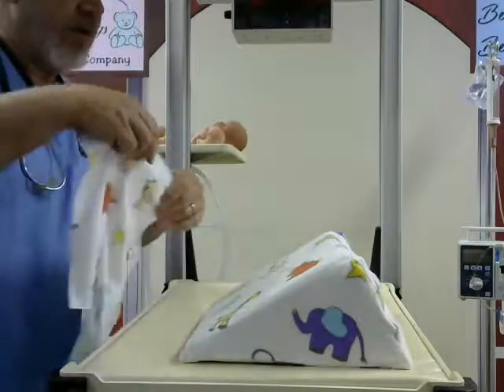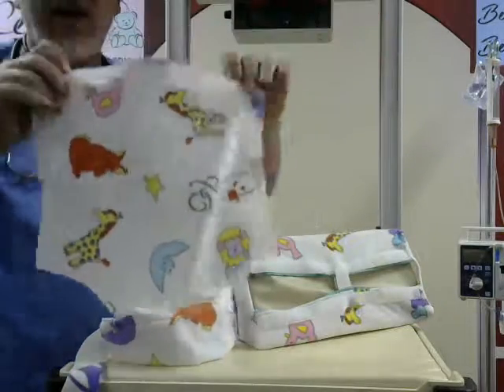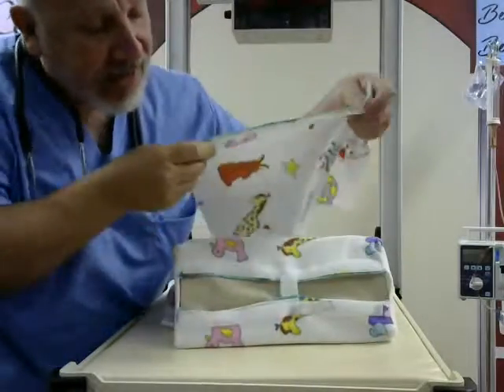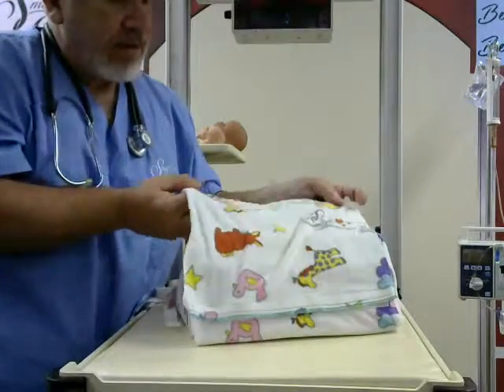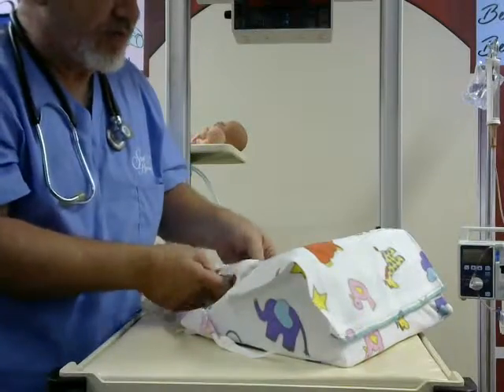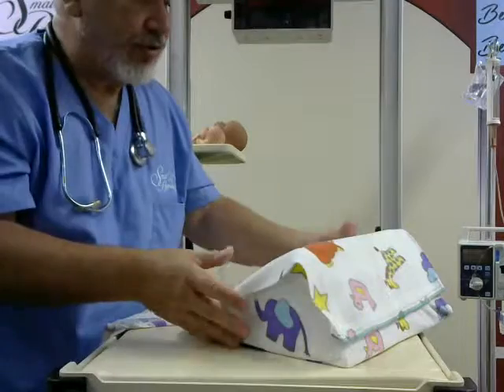The next thing we do is our harness. The harness looks like so, and it has a velcro strip that corresponds to the velcro on the device. You take this and attach it to the lower portion whenever possible, depending on the size of the baby. If you get a big baby, you may want to use the other one. For a small baby, you'll use a different one — you have two to choose from.